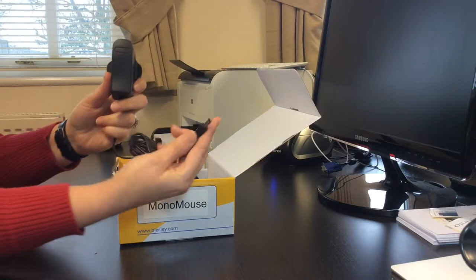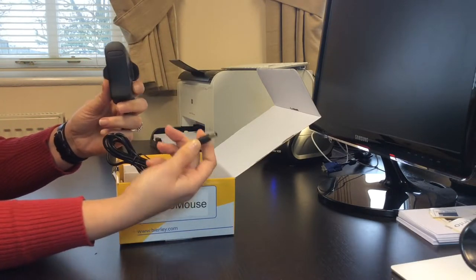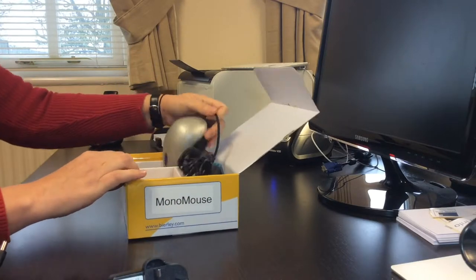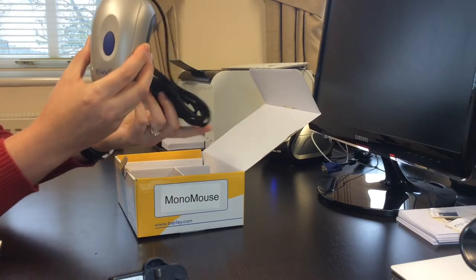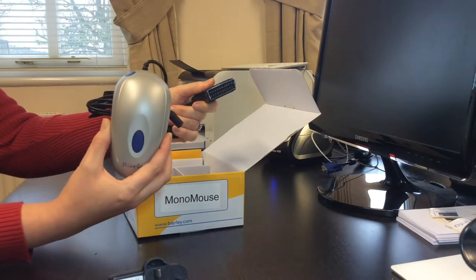In the box you have a power supply with a barrel connection to suit the country you live in. You also have the Monomouse magnifier with a SCART connection, a second barrel and 9 feet of easy store cable.